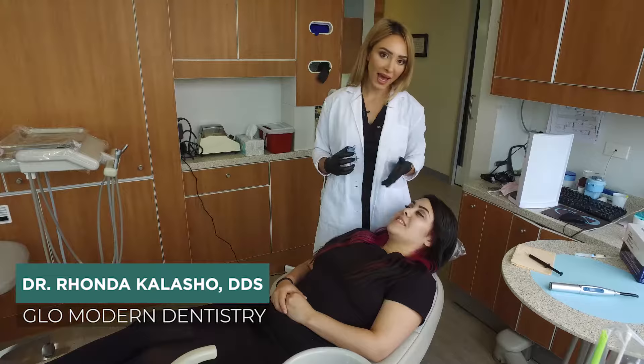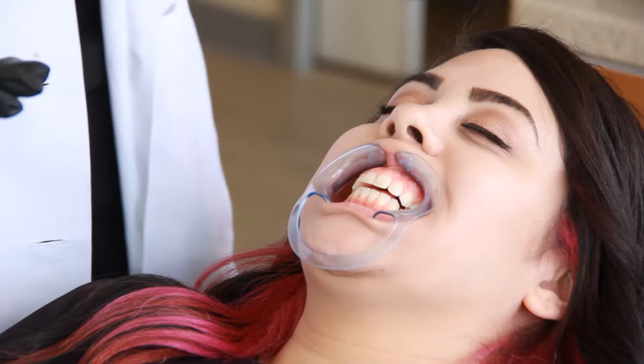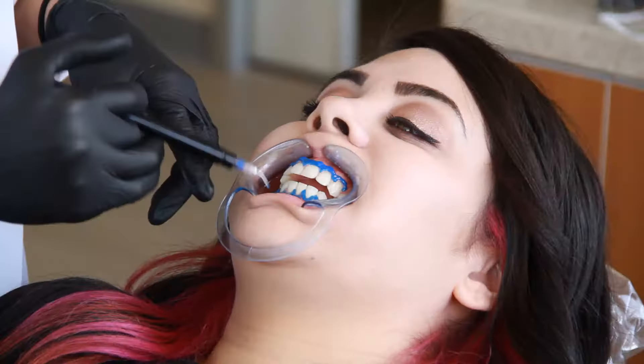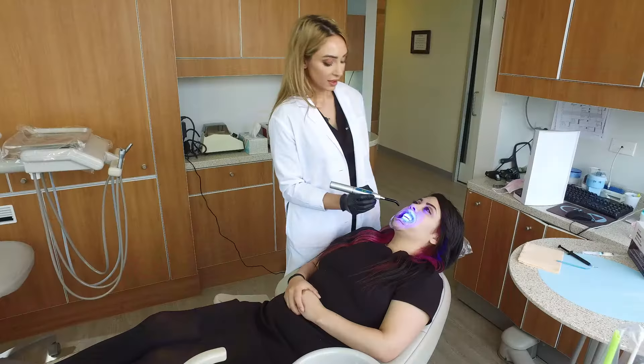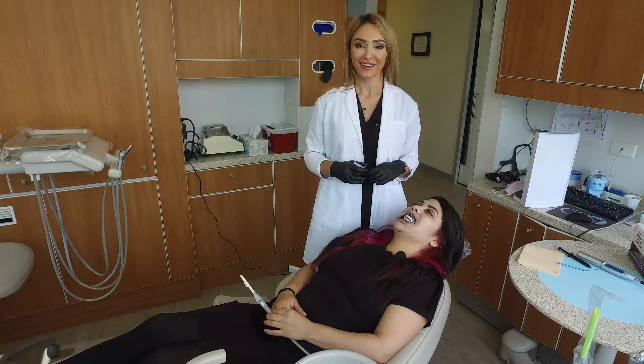We got to put this guy on — okay, so we put this on her gums. Look sexy, Sabrina! Now what I'm doing is light curing the gingival barrier.